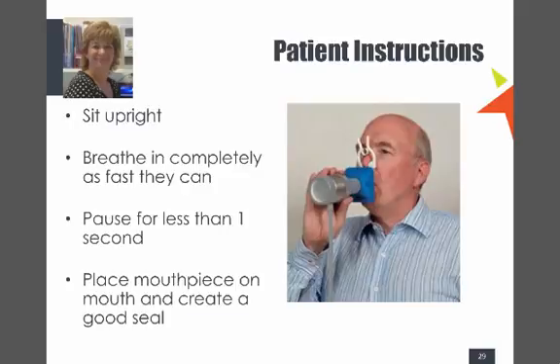And it is in the guidelines that they're supposed to be sitting with their feet firmly on the ground. Now this is a picture with a nose peg. I'm not sure if the guidelines are to use nose pegs. However, a lot of patients find it really uncomfortable and it almost puts them off. You don't lose a huge amount of air out of the nose for spirometry. If you're doing a full lung function test, it is probably a lot more pertinent that you are using one.